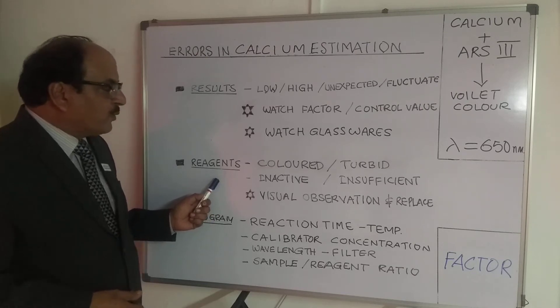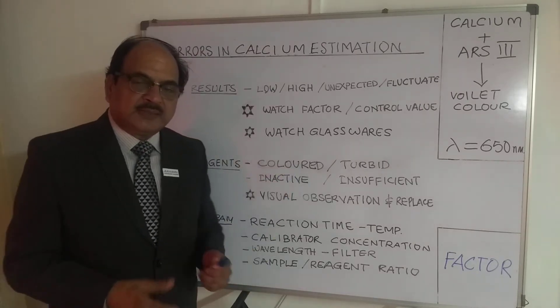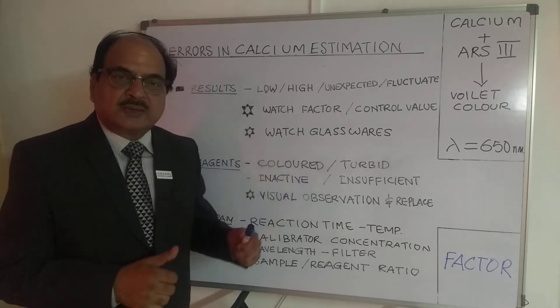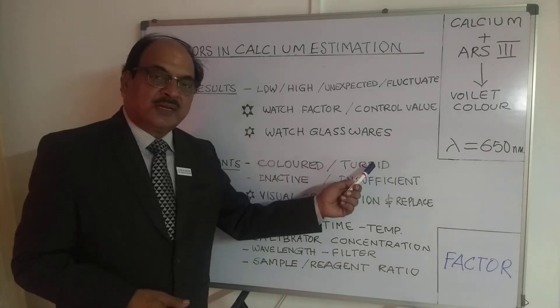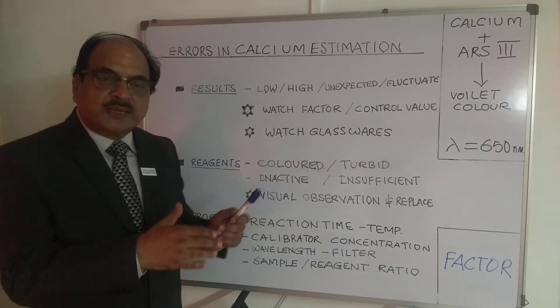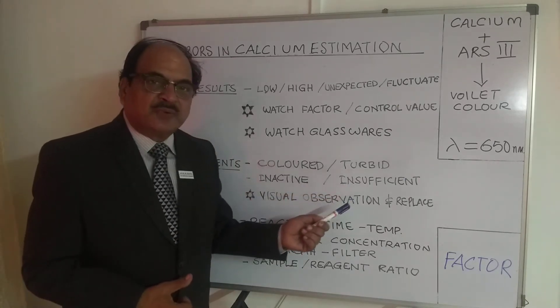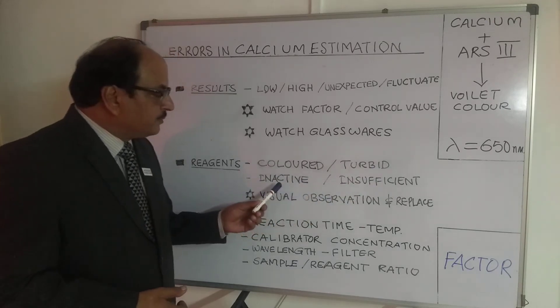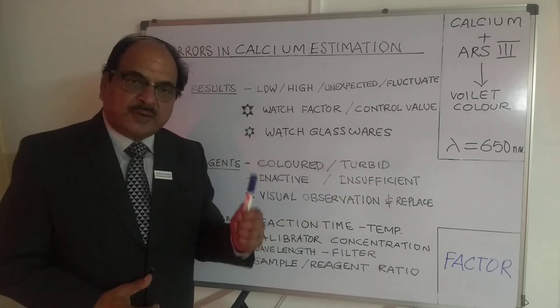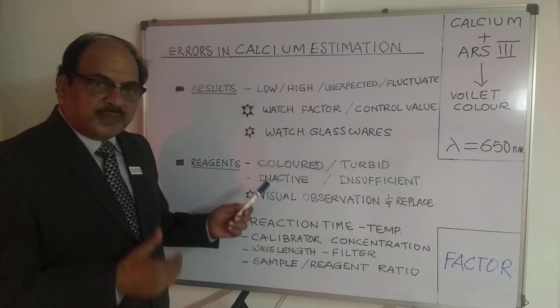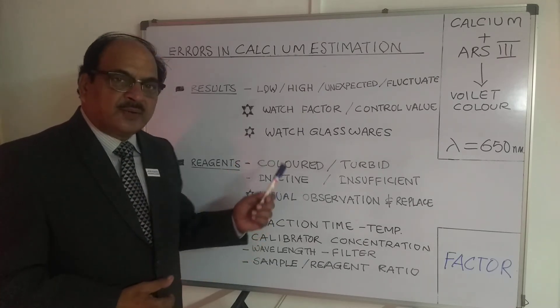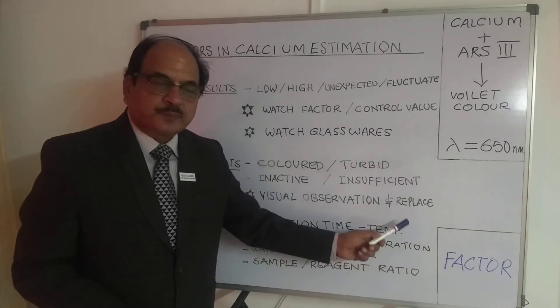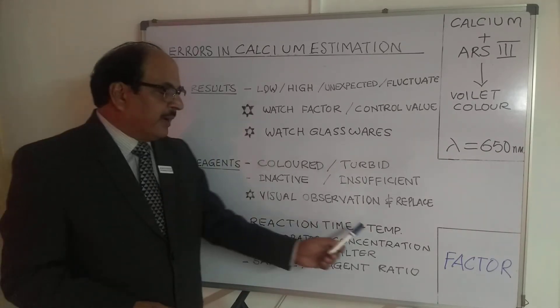Now let's look at reagent-related errors. The calcium arsenazo reagent is normally a dark reddish color, but contamination can change this. The reagent could become turbid due to heavy contamination, become inactive due to pH changes from contamination, or become insufficient in quantity — with air bubbles being drawn in during the last few milliliters. To avoid these errors, take the reagent into a beaker or test tube and check against light. A small volume in a long test tube can reveal whether the color is normal and whether there are particles. If you find any such issues, replace the reagent.